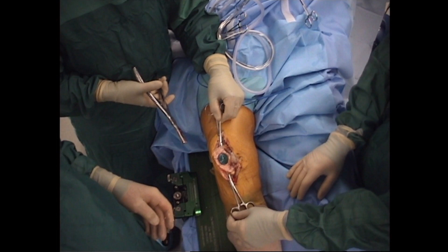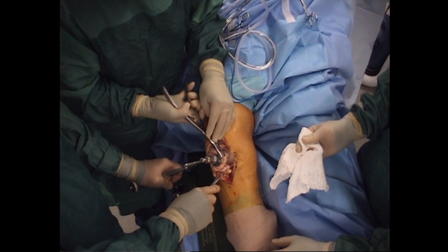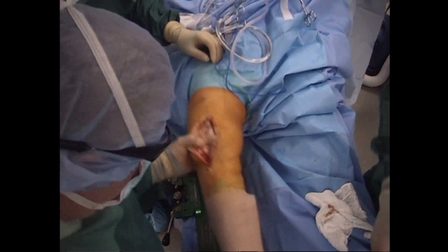Given that we are doing a cementless knee, we recommend different saw blades be utilized for each of the cuts to maintain as perfect a cut as possible. At this point, the lateral patellar facet is resected with a rongeur, and the patella is allowed to subluxate laterally, and the knee is flexed.